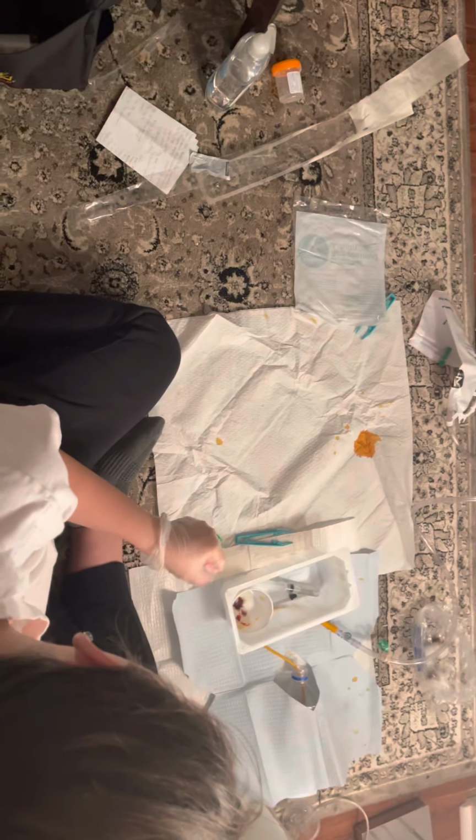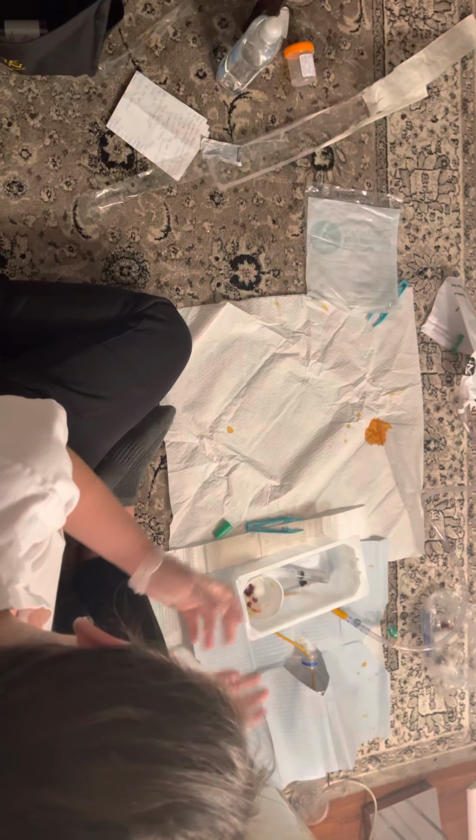Next, I'm going to place my drainage system, let's say, over the bed, below the bladder level, and I'm going to ask my patient if they're in a comfortable position. I'm going to lower the bed and raise the bed rails, and I'm going to begin by disposing all of my material.